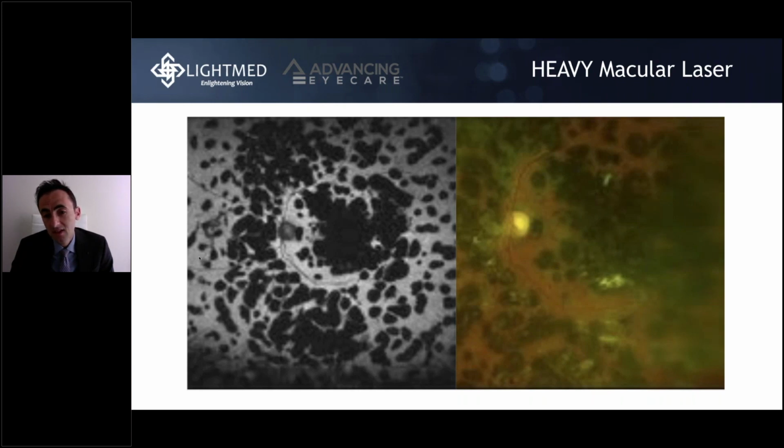the old green laser that I've encountered in the past, sometimes it might take 7 to 10 minutes, because even the optics on the old lasers are not the best. So you have to tilt your slit lamp microscope for the laser in order to get the perfect balance. And on top of that, you're applying single spots, so it will take you longer to treat a reasonable area of the peripheral retina that is ischemic. Okay.